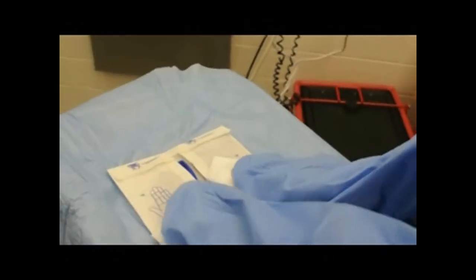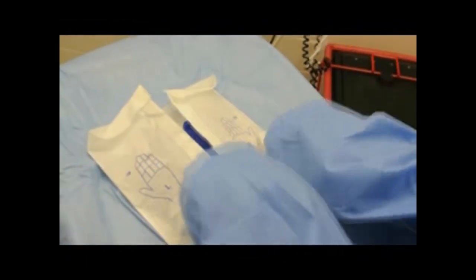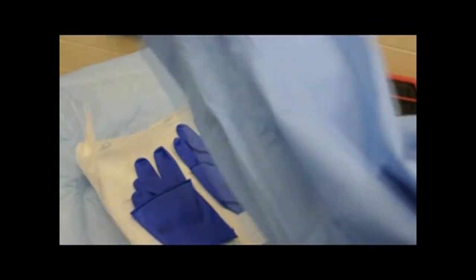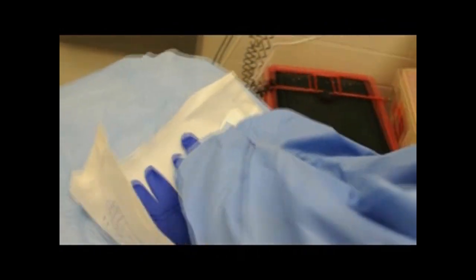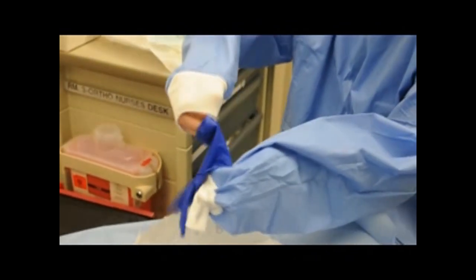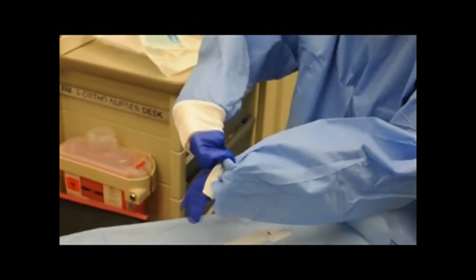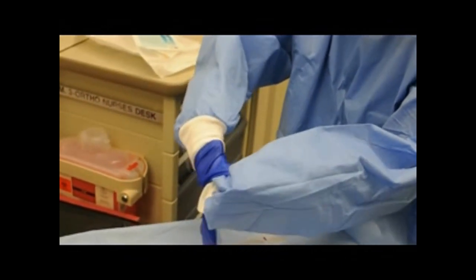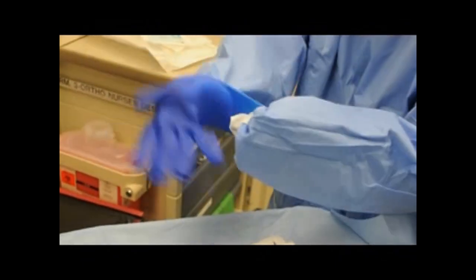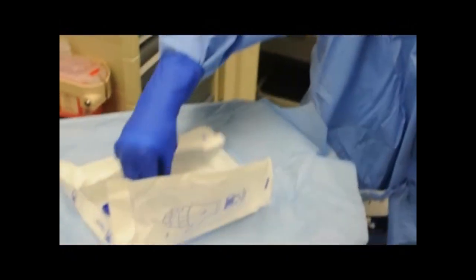Now make sure your hands are still inside the blue gown, and through it, unfold your underglove package. Grasp the bottom of a glove and slide your other hand into it, while simultaneously working your hand up past the white gown trim. This may take a while your first time. Once your hand is gloved, it is sterile, and you can use it to put on the rest of your gloves.